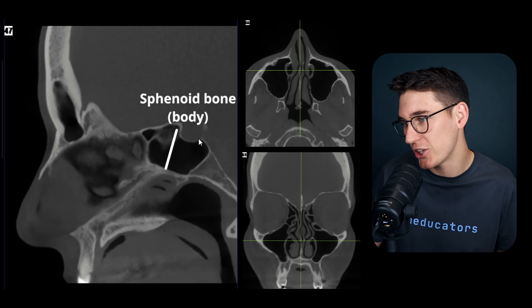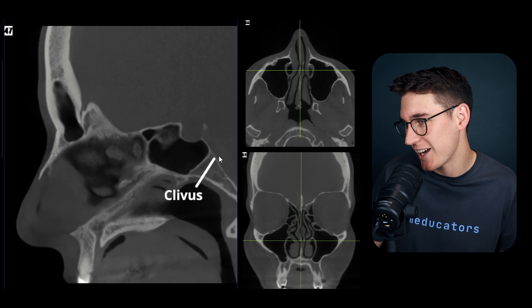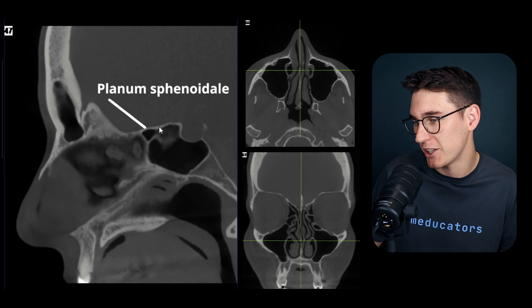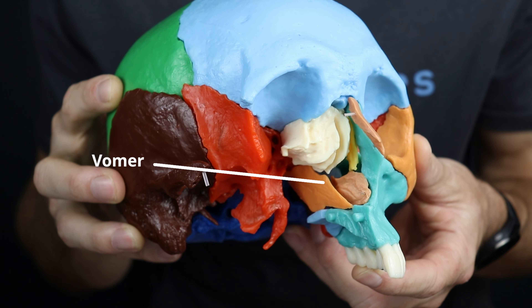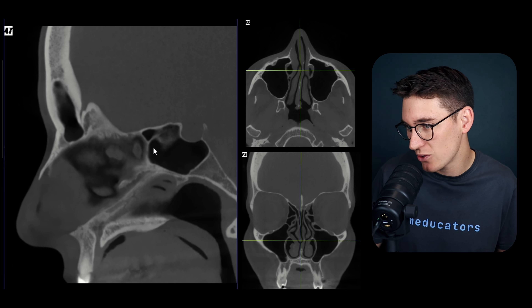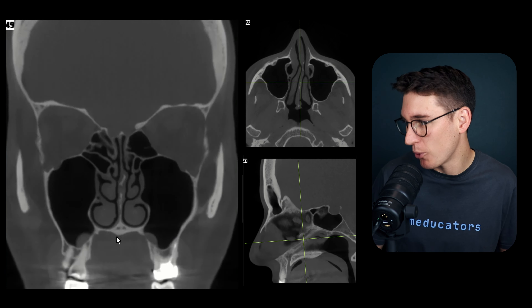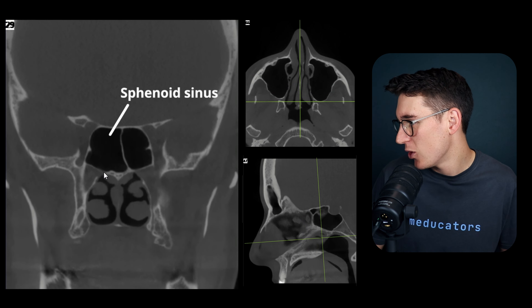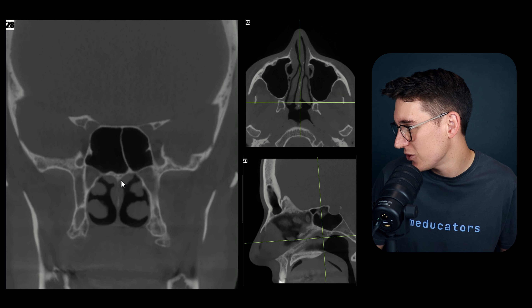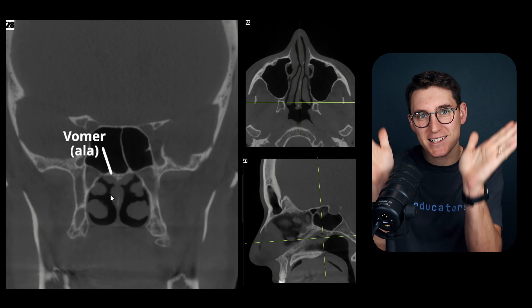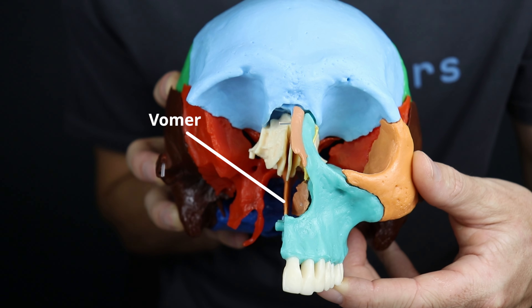The vomer extends from the body of the sphenoid bone. On the sagittal view we have the hypophyseal fossa, the clivus, the planum sphenoidale, and inferiorly the vomer extending down towards the palatine process. The vomer attaches to the sphenoid bone at the inferior sphenoid rostrum. On our coronal slice we can find the sphenoid sinus and see the rostrum, with the vomer extending to it and two small wings called the alae of the vomer attaching to the inferior surface of the body of the sphenoid.